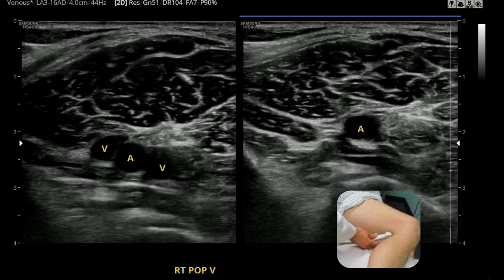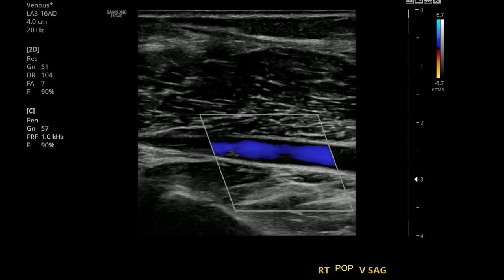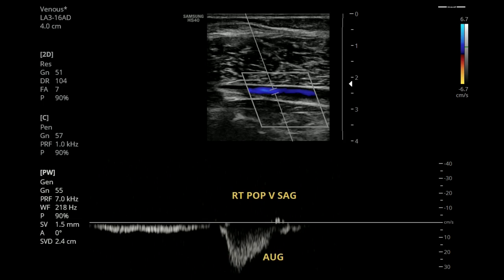After the femoral vein distal, we go behind the knee and get the popliteal vein. Most popliteal vessels come with one artery and one vein, but we found that our patient had a variant where she had two veins and one vessel — this variant is considered normal. Here's the color and also the augmentation in the waveform for the popliteal vein. Sometimes it's hard to do the augmentation because you need to have your arm anchored down so you don't move when trying to press the buttons on the machine. You need to have a steady hand, make sure it's anchored with little to no movement at all.